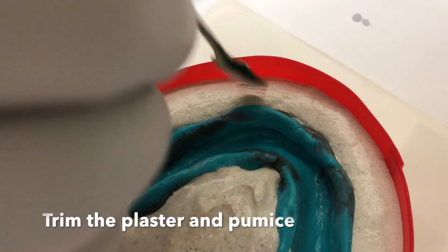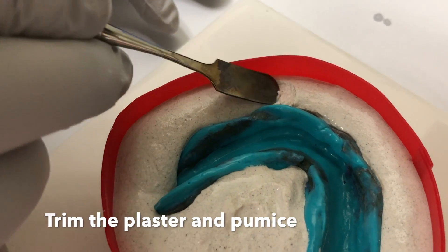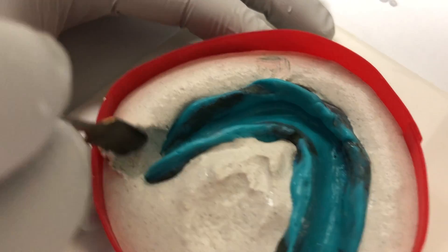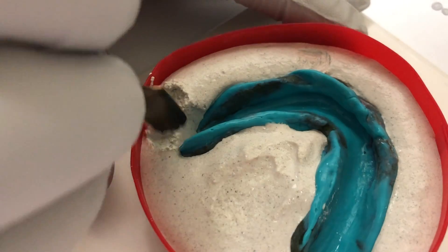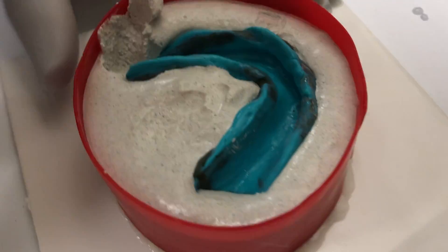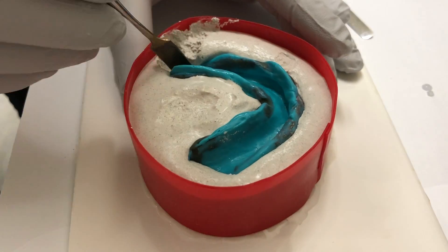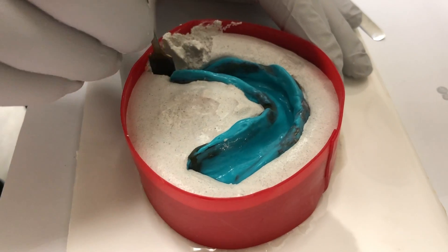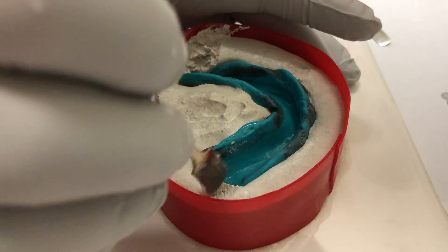As the material starts to set, use a wax spatula number 31 to remove excess plaster and pumice around the impression. You should have around 3 to 4 mm of the impression borders exposed above the plaster and pumice all around the borders of your impression.